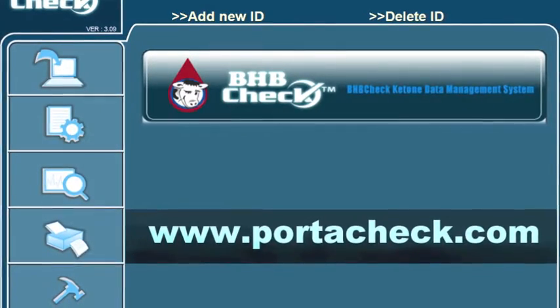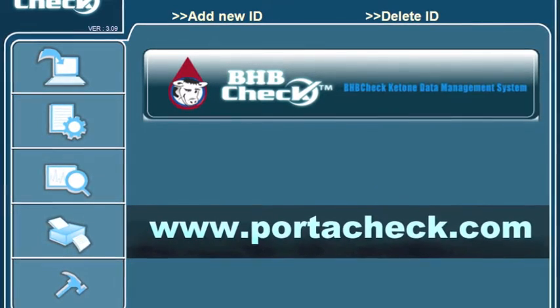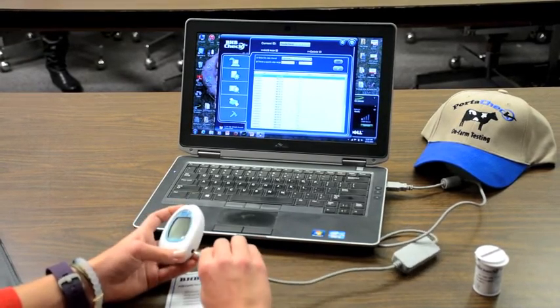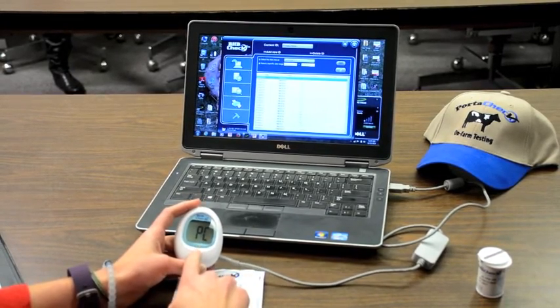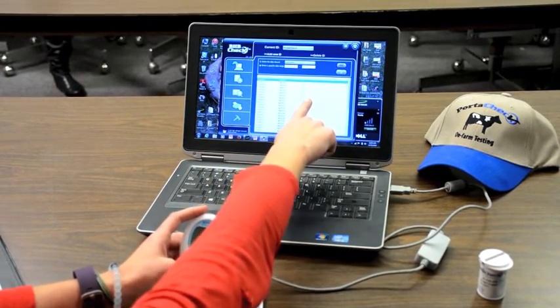Download the BHB Check ketone monitoring software from the PortaCheck homepage, www.portacheck.com, and connect your meter to the computer using the BHB Check cable. The meter will read PC, and up to 450 test results can be transferred. The data will download in the form of date, time, and BHB reading.